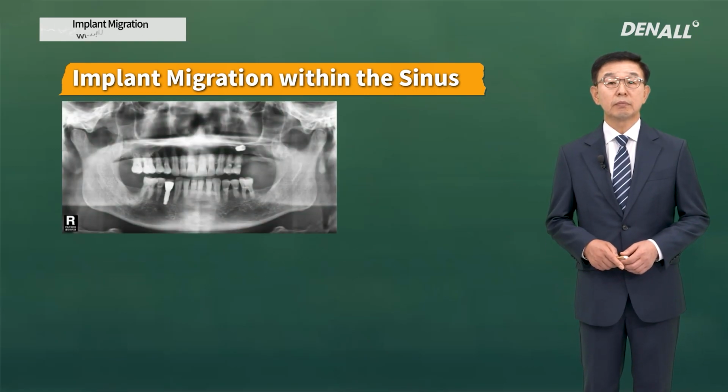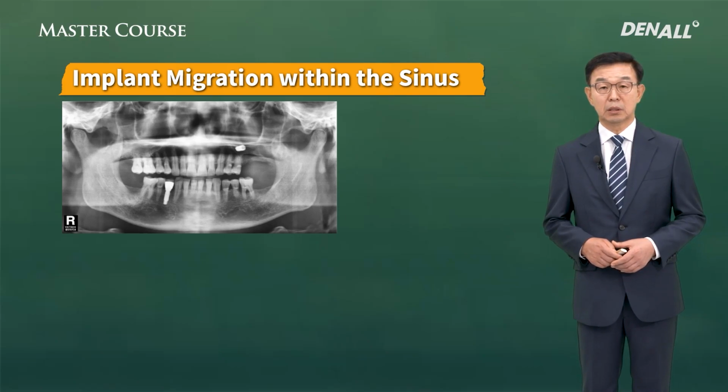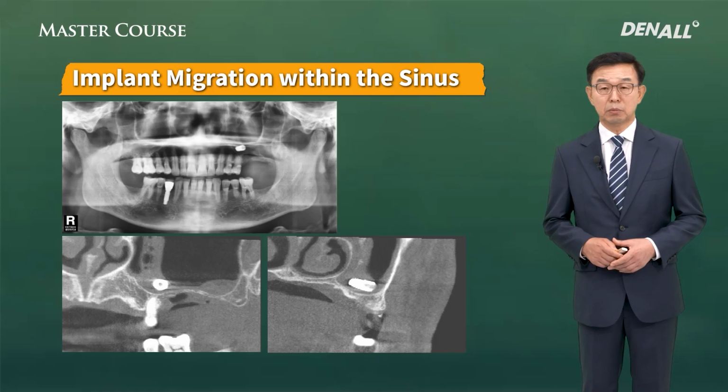In the case of this patient, the original intent was to place the implant in the upper left posterior area using crestal approach. However, on the X-ray as shown, the implant has migrated into the sinus and the patient came to my dental clinic.